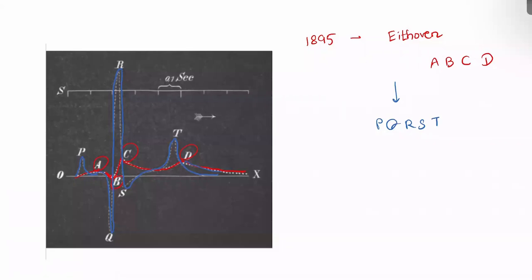He was a mathematician or physicist, someone like that, and he named PQRST for successive points on a graph, like P, Q, R, S, T. The ECG is also a graph, and so he adopted this Descartes PQRST. It is another concept. Okay, whatever, now we are using PQRST for the ECG.